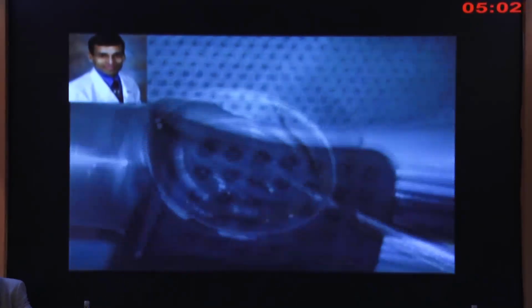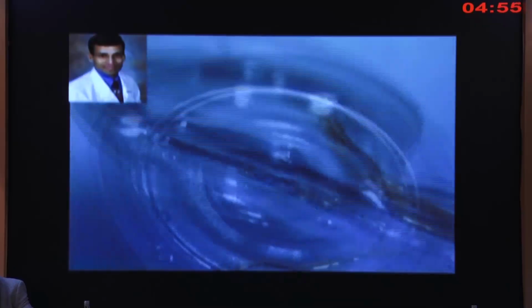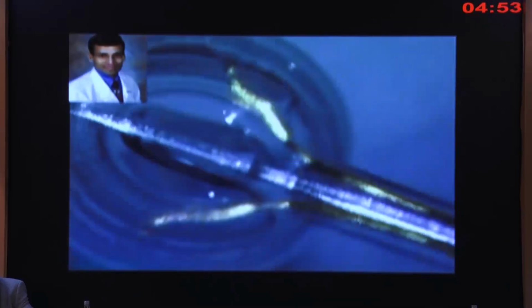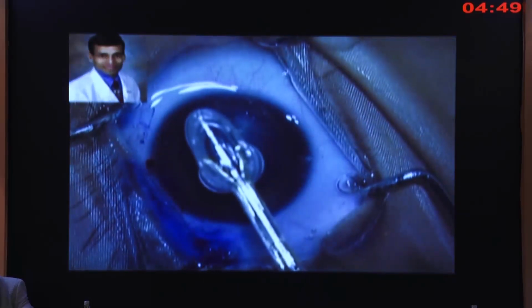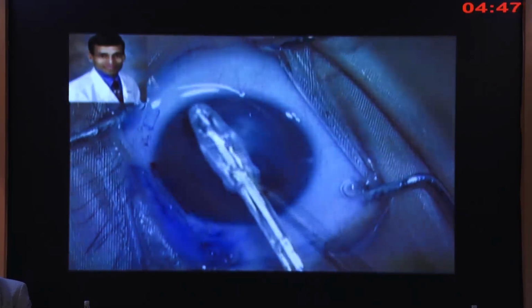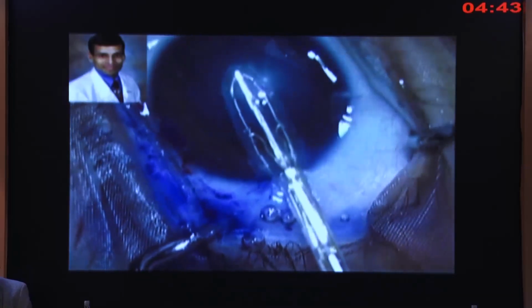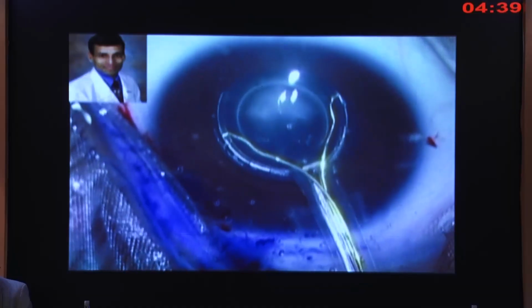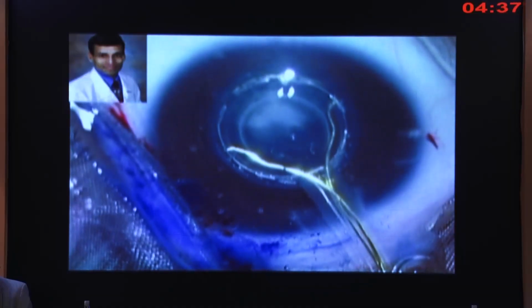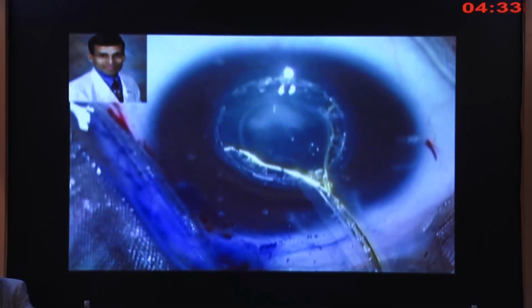As we know, in pediatric cases, creating capsular rexis is a little difficult because of the highly elastic anterior lens capsule, and the Zepto also has some limitation that you have to insert the silicone cup inside the anterior chamber. So in cases like pediatric eye or shallow anterior chamber, you have to be careful doing this technique. We used chondroitin sulfate viscoelastic to coat the endothelium, and the anterior chamber depth was normal.